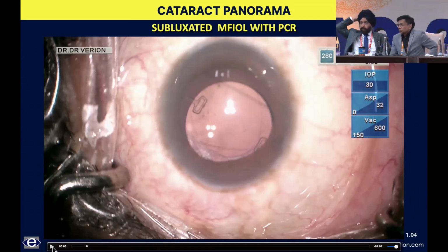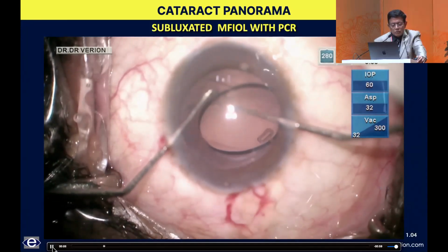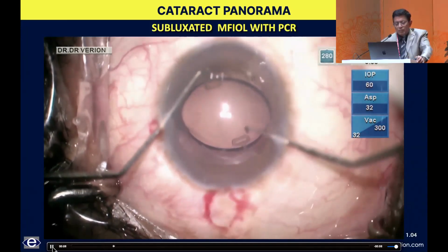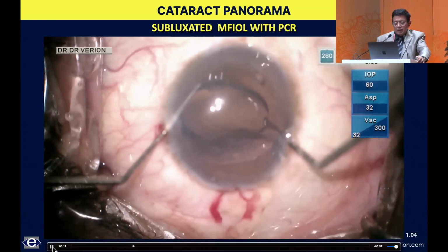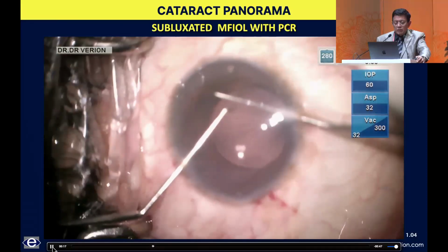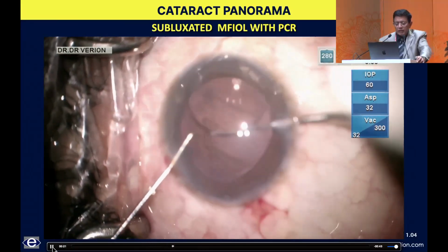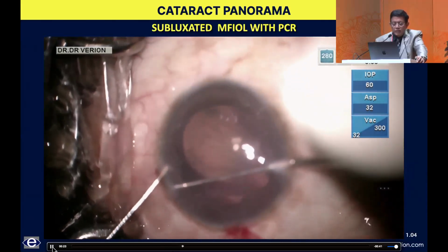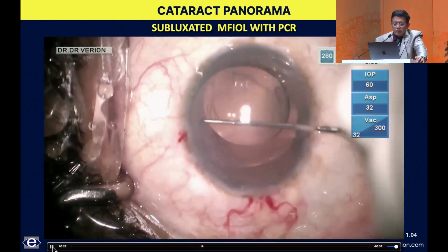Okay. Let's see the various ways to skin the cat. This is what I am doing. So there is enough amount of rexis support over there, and this is gymnastics. I'm trying to get the lens out into the anterior chamber, so I'm using 2 Sinskey hooks, and I thought an adequate vitrectomy was already done 25 years back, but obviously I was not so meticulous at that point of time.